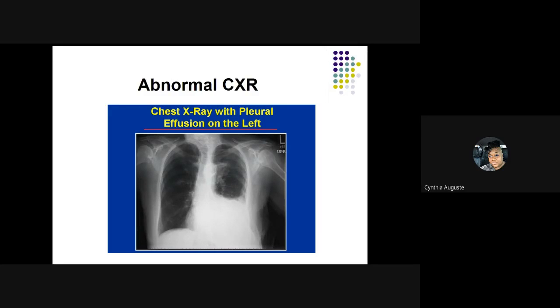I was asking, with all that, does it matter which side the patient lays on? Correct. Yes, it does. Because we would suspect that the pleural effusion is on the left side, you would lay them on the left side. Okay. Yeah, good question.